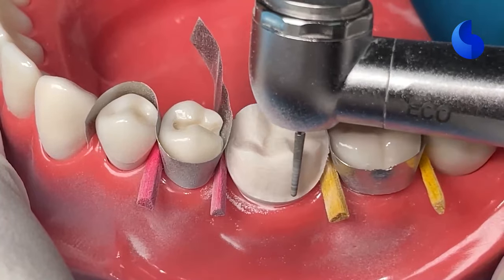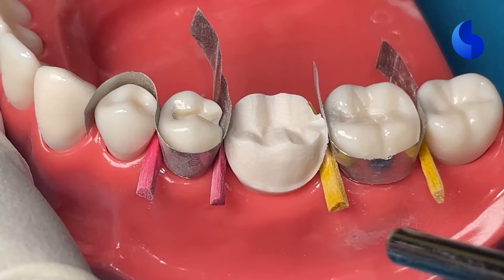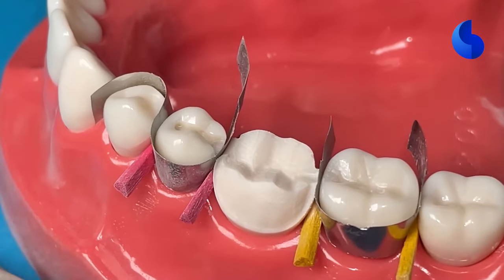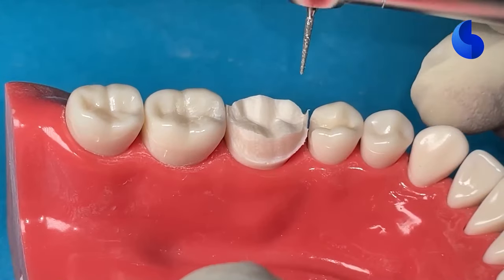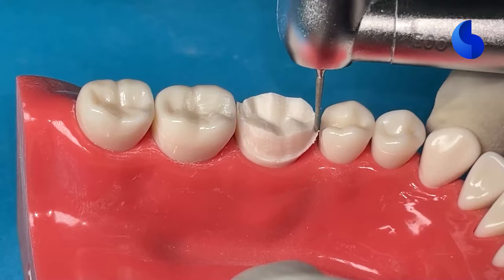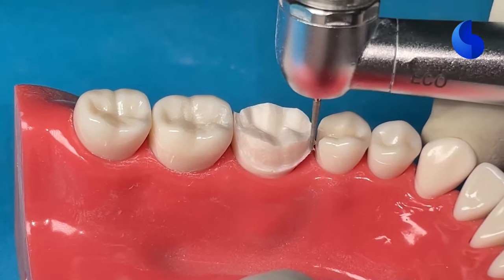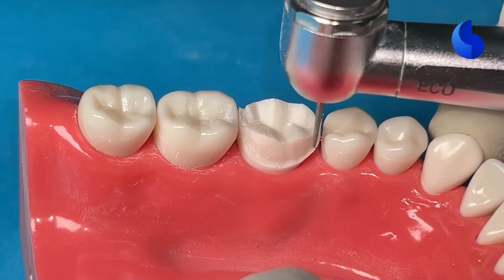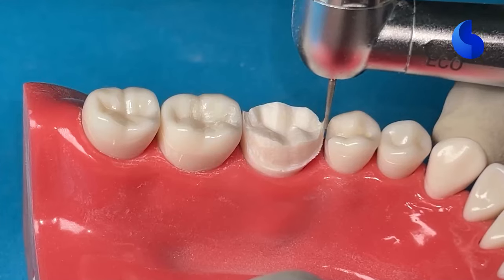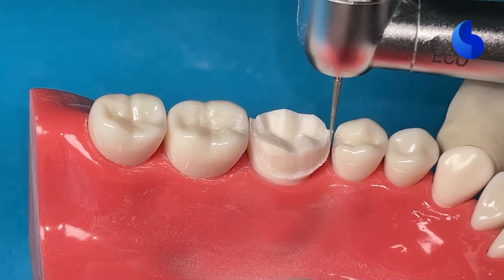So now that you're happy with the axial reduction, we can go ahead and remove these matrix bands and the wedges, and you can see how much space that's created there. So now we're starting with our interproximal reduction. You can use a very thin diamond like an 856-012, the diamond that we're using in this video. And if you don't have access to these diamonds, you can also use a straight fissured burr, like a 169L, and that also helps to go through this area.